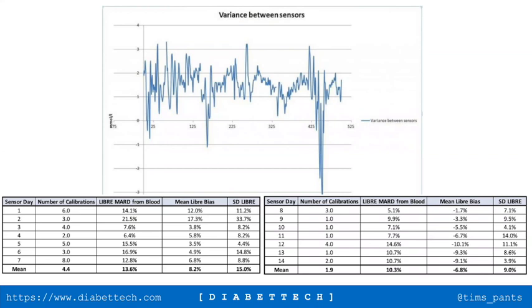I still haven't quite worked out from this conversation, I'm on a Libre, can you calibrate Dexcom sensors, or is the idea that you don't? So the G6 can be calibrated, but the idea is that you don't. And if you observe a measurable difference, you can calibrate it. If you're using G5, that's a once-a-day calibration model.